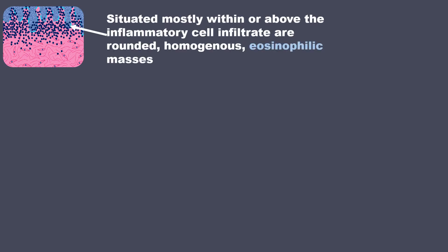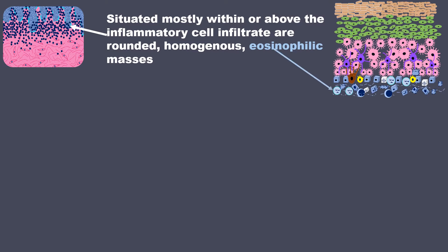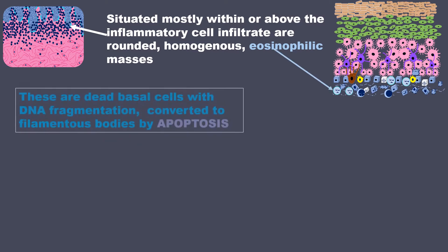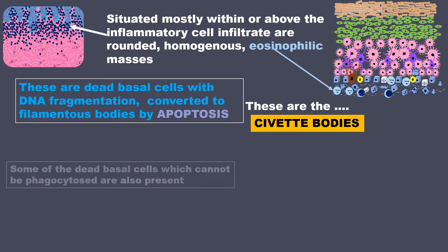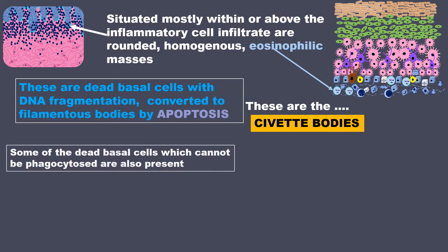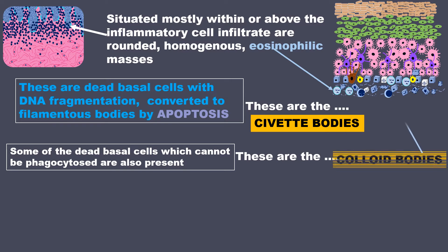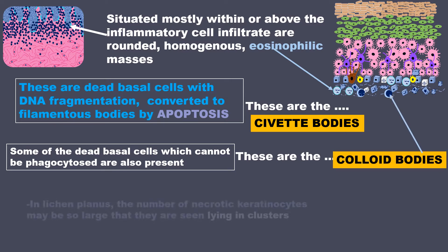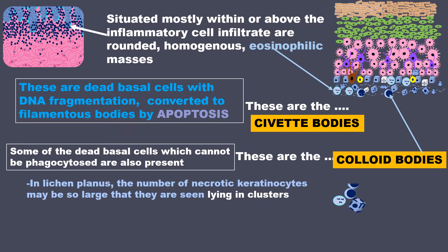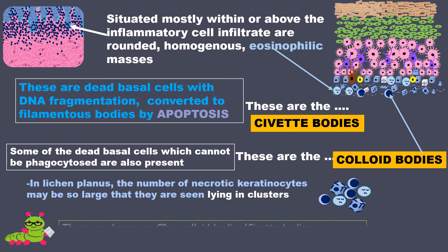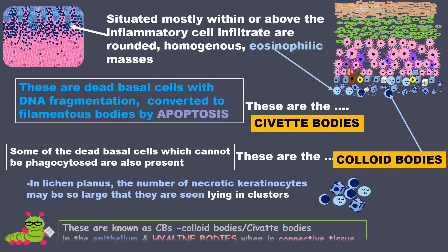Situated mostly within or above the inflammatory cell infiltrate are rounded homogenous eosinophilic masses. These are dead basal cells with DNA fragmentation converted to filamentous bodies by apoptosis, and these are called Civatte bodies. Some of the dead basal cells which cannot be phagocytosed are also present — these are the colloid bodies. In lichen planus, the number of necrotic keratinocytes may be so large that they are seen lying in clusters. Civatte bodies and colloid bodies seen in the connective tissue are termed hyaline bodies.